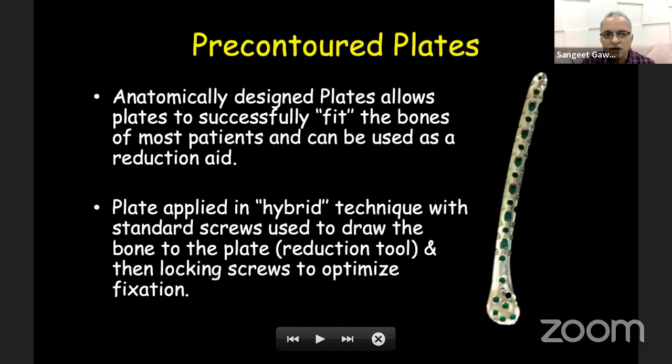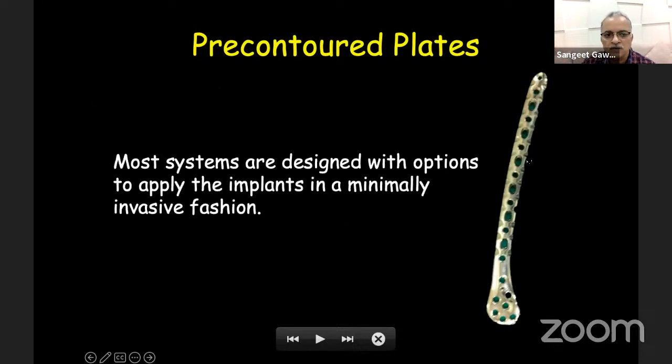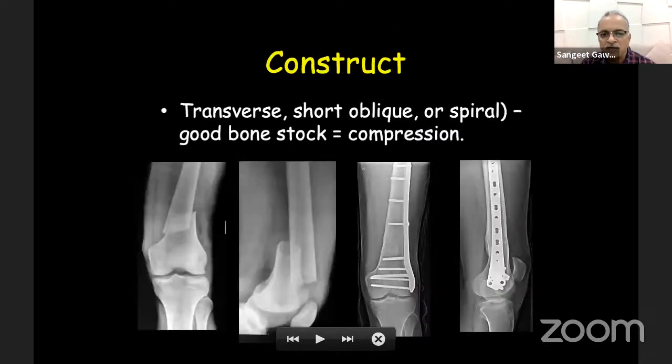Now, these pre-contoured plates are designed for a normal anatomical reduced distal femur. So the plate has to be applied in a hybrid way, wherein we use all the locking screws in the distal fragment, and you can use a cortical and mix and match with the locking screws, three or four locking screws in the proximal fragment. Most systems are designed with the option to apply the implants in a minimally invasive fashion.